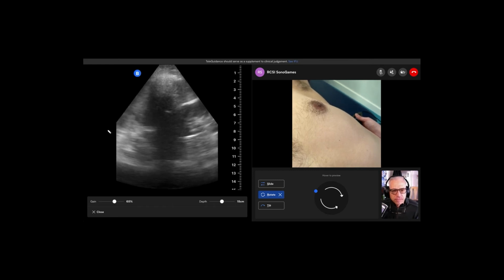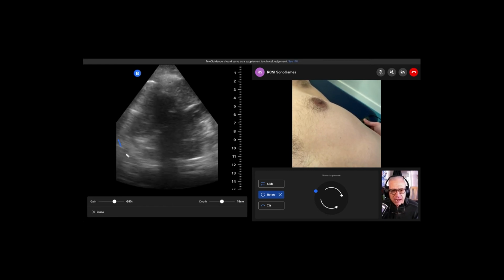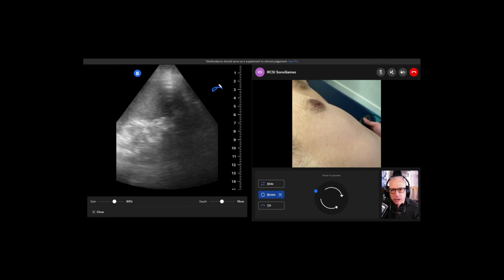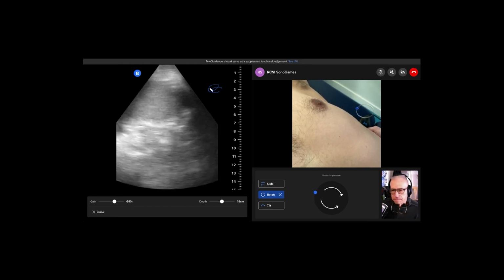So that's your money shot, is to try and get a little bit of that diaphragm that you had over here and look for blood there. And then you can slide down to the paracolic gutter over here. Or because he's been thrown off a motorbike.